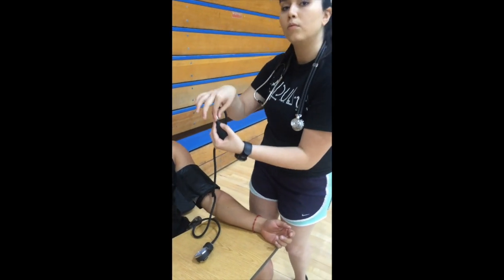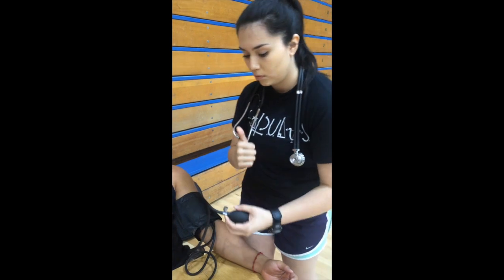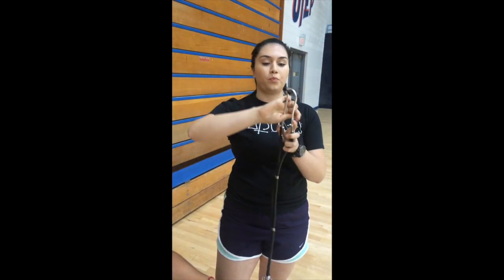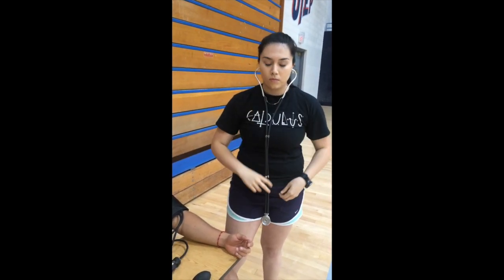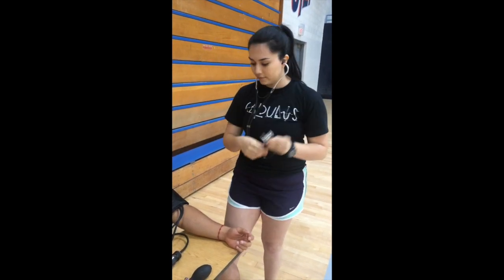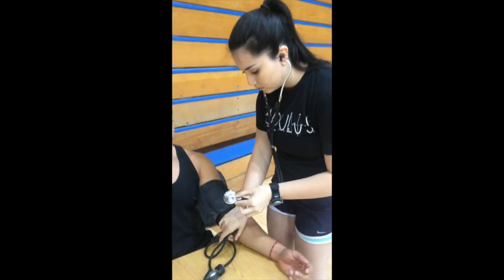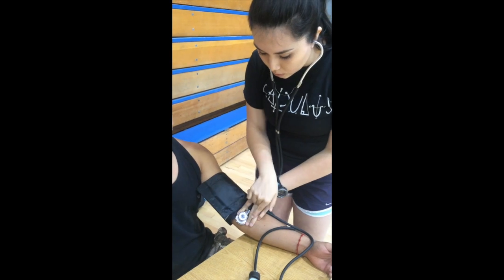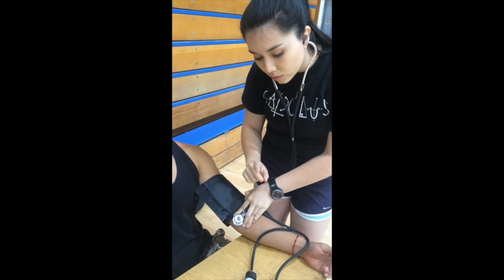Remember to turn the knob all the way to the right before you begin pumping. Now, get out your stethoscope. In regards to the prongs, make sure that the ear pieces are pointing away from you — if they are pointing towards you, you are not going to be able to hear anything. Tap on the diaphragm to make sure the stethoscope is on. Place the bell on the brachial artery with the index finger and the middle finger on either side of the bell.